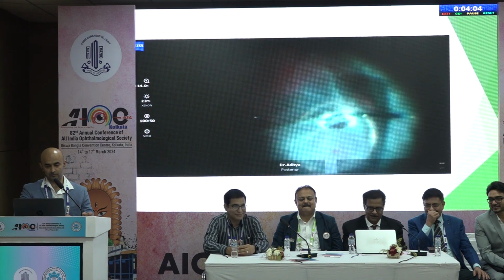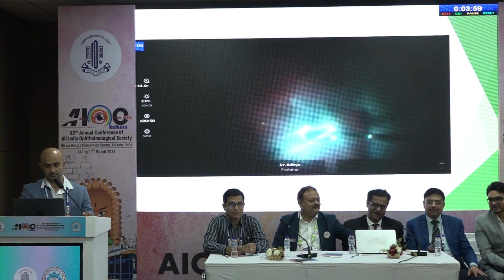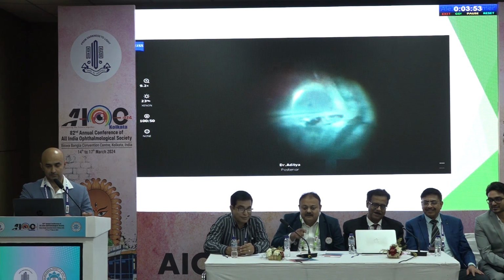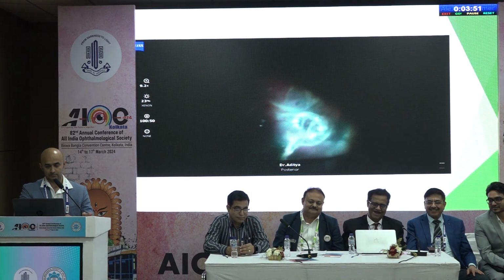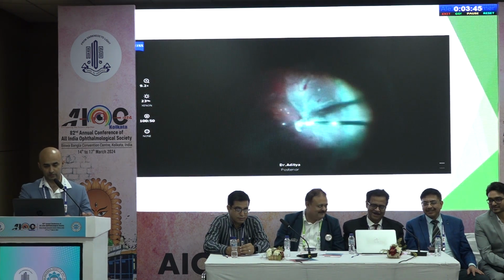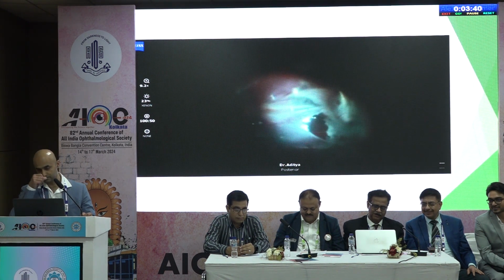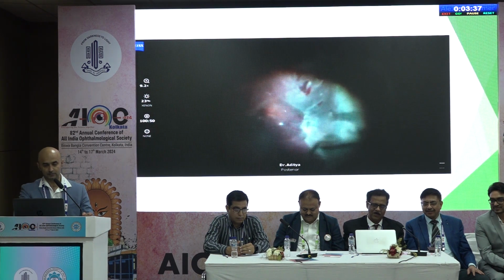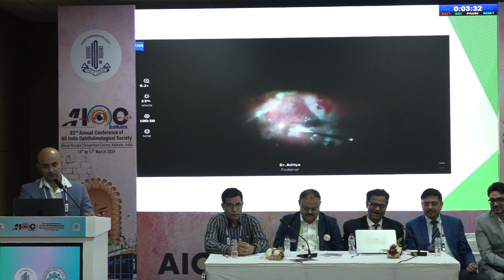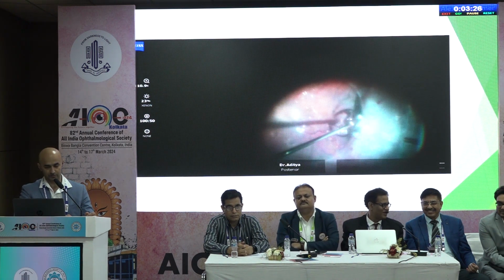You can see another bubble of silicone oil now just under the retina. So once this subretinal band was taken care of, the silicone oil globule was again removed from the same area. It gets really difficult because the silicone oil removal cannula doesn't reach that far, and our 25 gauge vitrectomy cutter is too small to aspirate the silicone oil from the subretinal space.